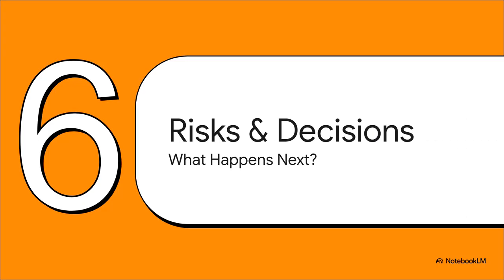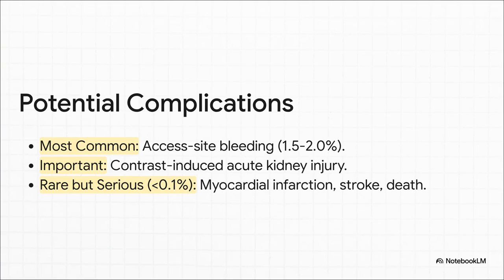Finally, we have all this incredible data. The pictures, the pressures, the FFR. Now what? We have to weigh all that information against the potential risks and figure out the absolute best path forward for our patient. Now, this is a very safe procedure overall, and serious complications are thankfully rare. But it's not zero risk.